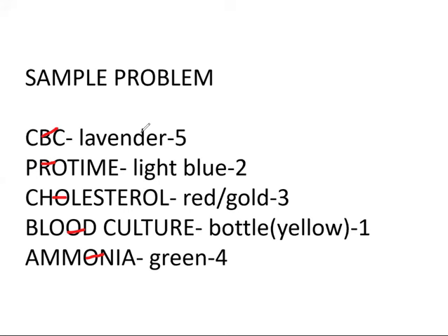That is why it's very important to revisit our prelim topics on the sections in the laboratory, like hematology, where the tests are listed. You may know the order of draw but not know where each test is properly placed, so it's useless. So memorize which tests go where, therefore this one goes in this evacuated tube.